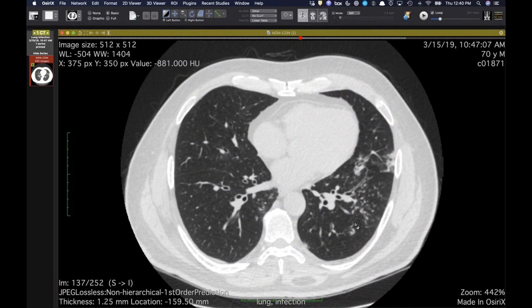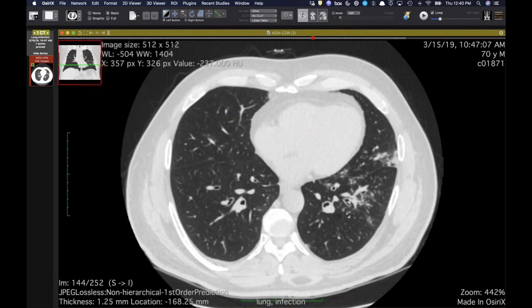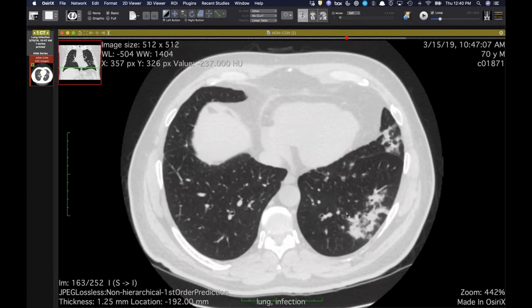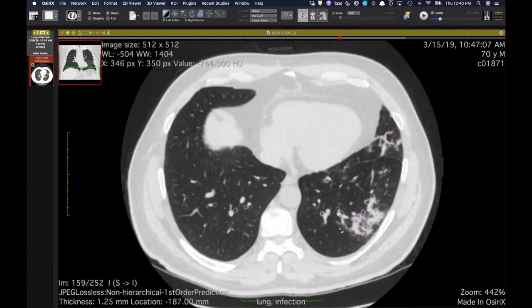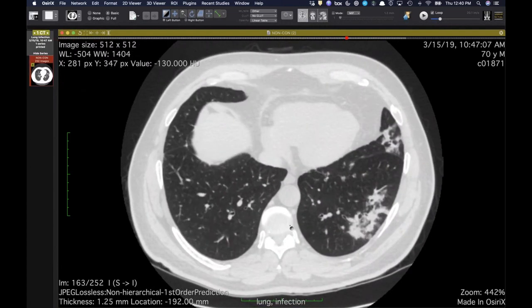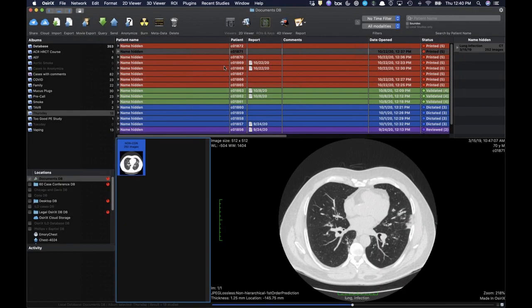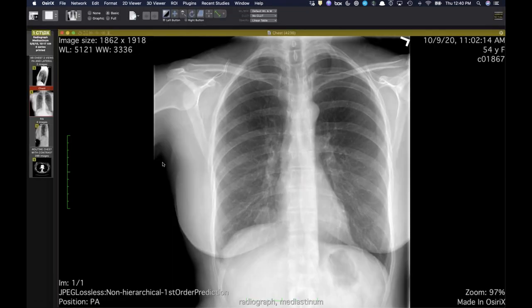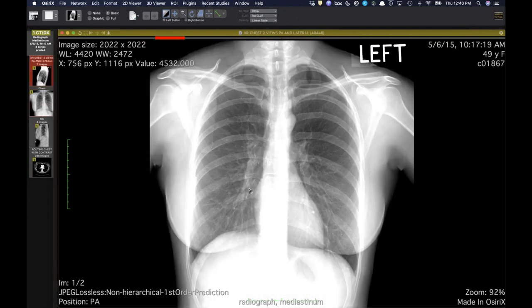So Travis, the other thing that will give you these reversed halo signs, atoll signs in the bases like this, is another fungus, paracoccidioidomycosis, used to be South American blasto. That was the classic finding in that, these reversed halo signs, and I think basal predominance. I thought you were leading in that direction, given your fungal lead-in with earlier cases today. No, I don't think I have any paracoxy that I can think of recently, at least. Maybe you have to go to the south end of the valley to get those cases. Maybe.